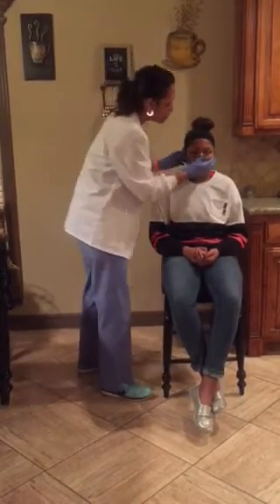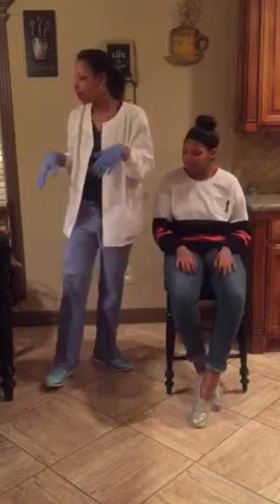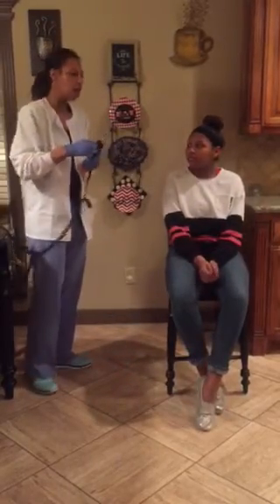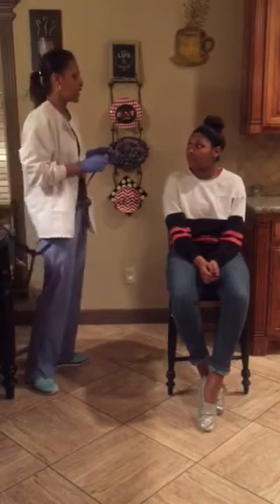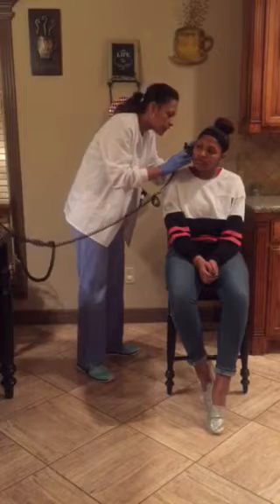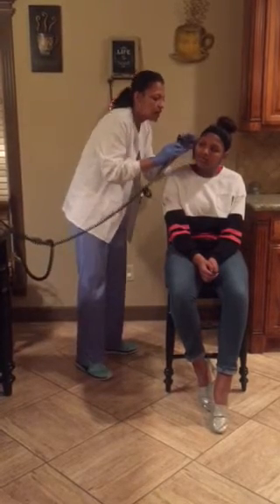And your ear looks good. No drainage. You haven't noticed any drainage in your ears? Okay. So again, with my otoscope, I'm going to put the little tip on the end, and I'll be checking your ears. Okay. All right. So I'll lift up and pull down, look up and down, and your ears look good.